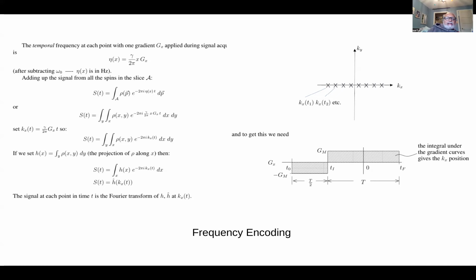So you detect at a particular frequency. So in a radio, right? An AM station will broadcast at so many kilohertz. And then your radio actually subtracts that kilohertz off, and so what you're left with is just small changes in the frequency that correspond to voice and music. So that's what happens here.